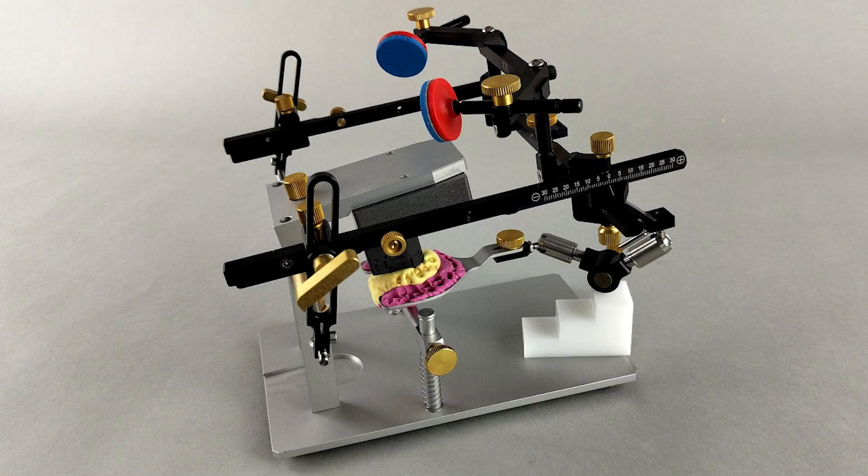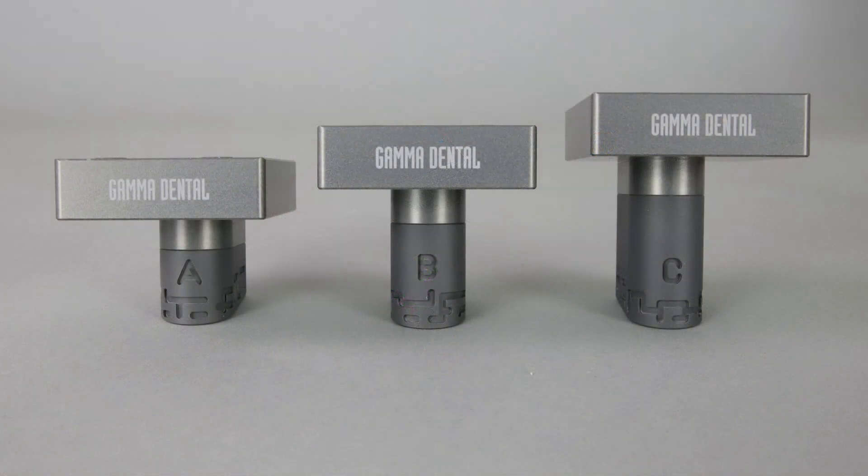The Digital Transfer Block Set comprises three individual digital transfer blocks of different heights, labeled A, B, and C.